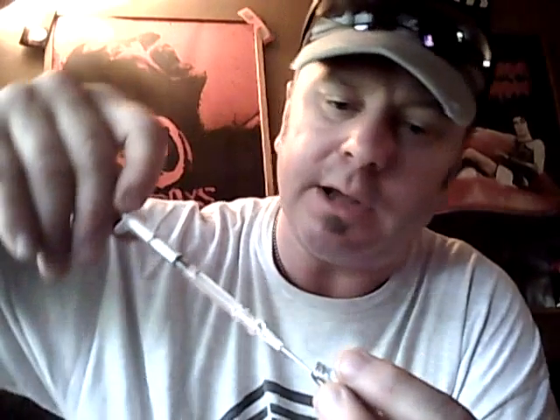One thing you have to do before you do this is flick the bottom of the ampule. I can draw it out at the top just as well, so it doesn't matter. So hey, I made a mistake, and it's a learning experience for everybody then. And usually you can get it where there's some, until you start drawing in air if you're lucky.